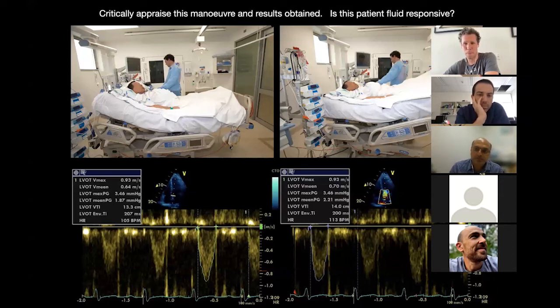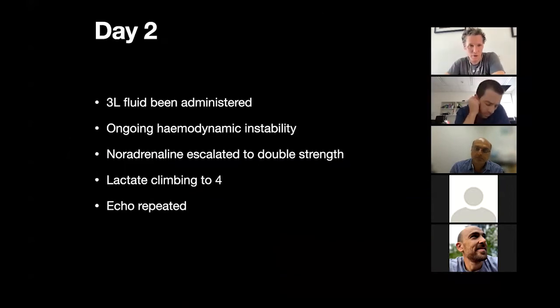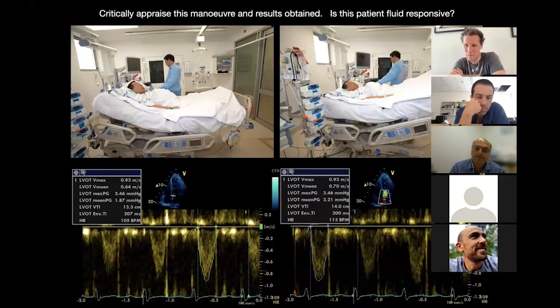One more thing, Sam. So do you always club this measurement with the E measurement? So how much the change in the E or EA ratio, whether the patient actually got the fluid bolus? Really nice. I think that was actually part of my next one. No, it isn't. Tell me what you mean about that. So it's a great comment. Yeah, and I think it'd be a really nice thing. So I know you asked me the question, but I'm going to flick it back at you. Sure. Describe what it is.